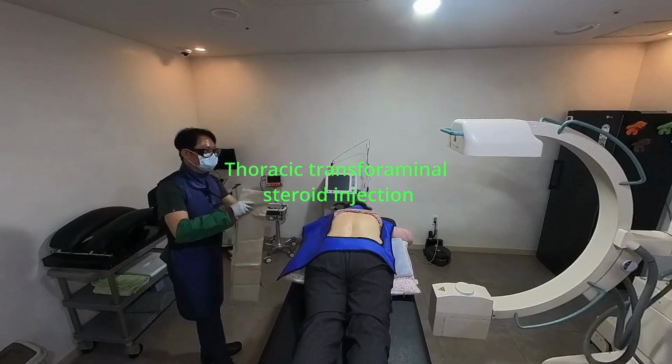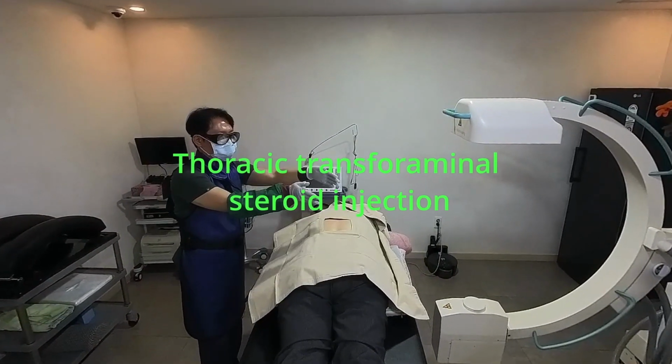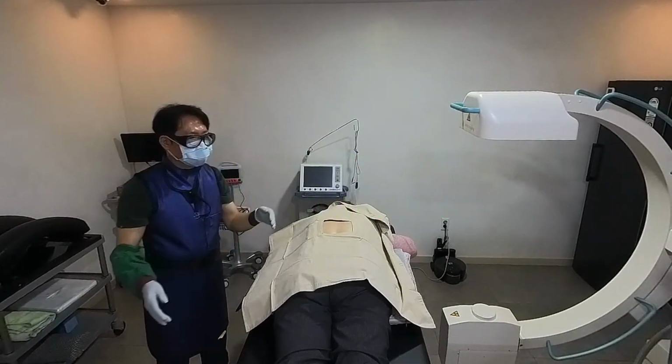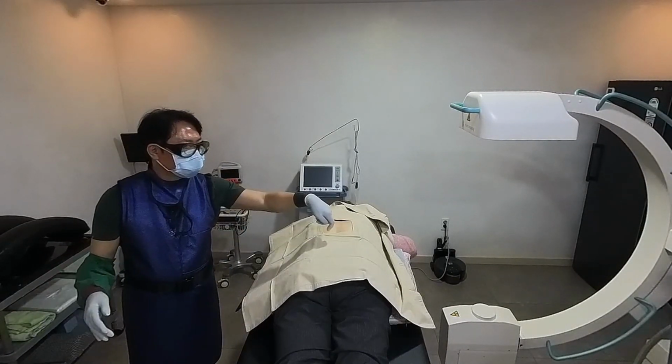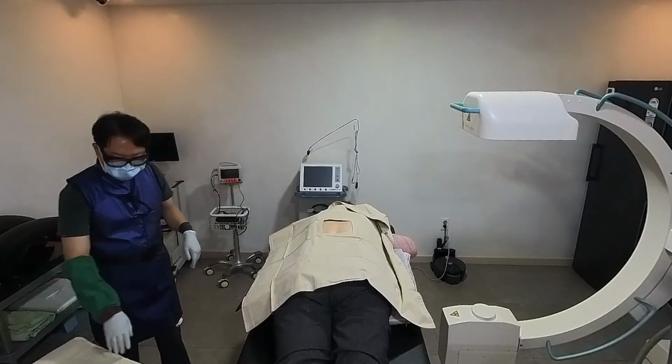I will be discussing an episode of another thoracic transforaminal epidural steroid injection technique. We will be focusing on bilateral T8 transforaminal injections. This procedure can be more challenging than lumbar or cervical transforaminal injections for several reasons.